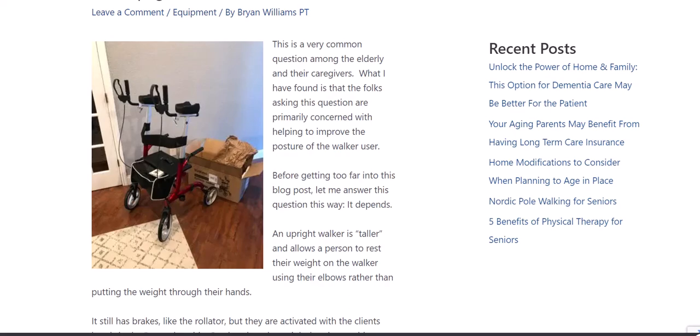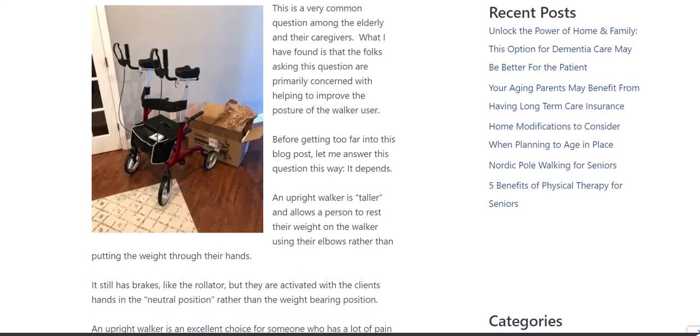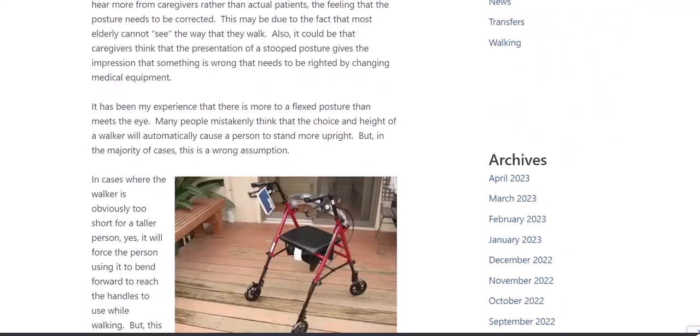For someone who has a bad back, or for someone who has poor hand coordination or hand strength and can't put a lot of weight through their hands, or maybe has arthritis in their hands, the upright walker may be a better option for them to weight bear through their elbows versus through their hands. However, I just wanted to highlight this article that goes into the reasons why an upright walker will not necessarily help you stand up straighter.